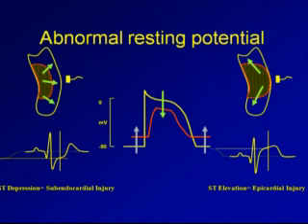When you see ST segment elevation, or the appearance of ST segment elevation, that's said to refer to epicardial current of injury. Subendocardial injury, there's only really one kind. Epicardial currents of injury can be due to ischemic injury or myocarditis or even pericarditis.